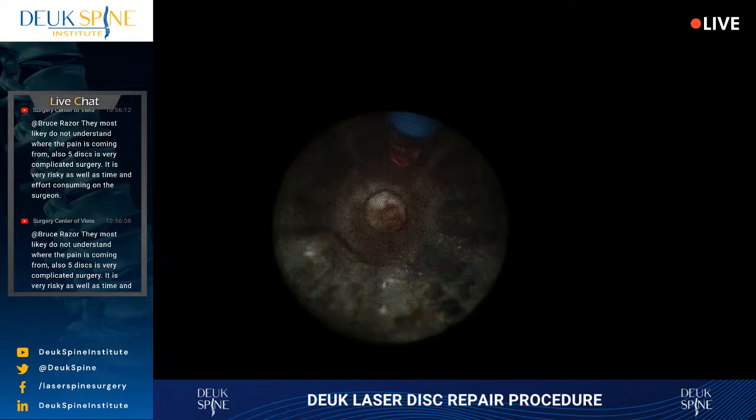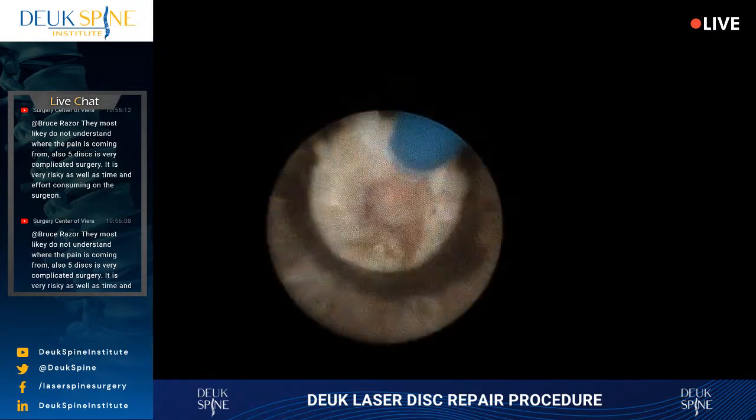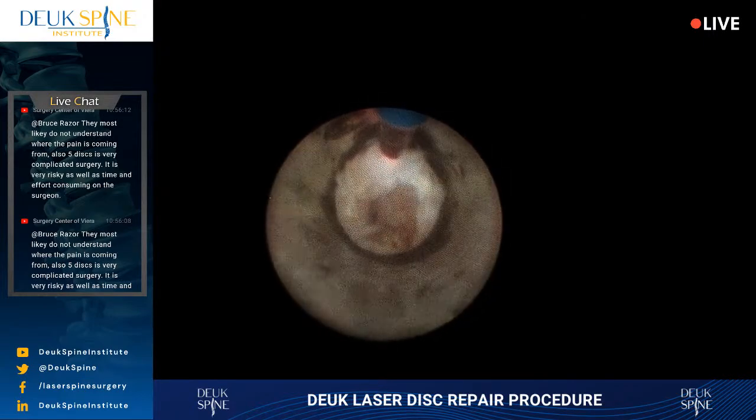Okay, watch that laser. You've got to not let this hit my face. Yes, sir. You've got to put your hand there. Guard it. Get your hand up there. Yeah.